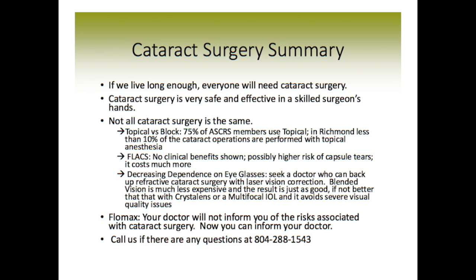There's topical versus block anesthesia, and 75% of American Society of Cataract and Refractive Surgery members use topical anesthesia today. In Richmond, less than 10% of the cataract operations are performed with topical anesthesia. Femtolaser-assisted cataract surgery has no clinical benefits, as far as I can see, as far as the scientific literature has shown to date. Possibly there are higher risks of capsular tears with it, and it costs much more.